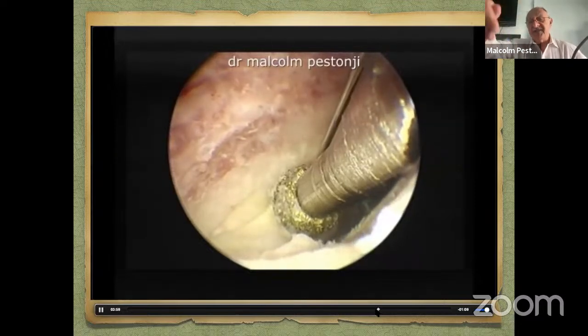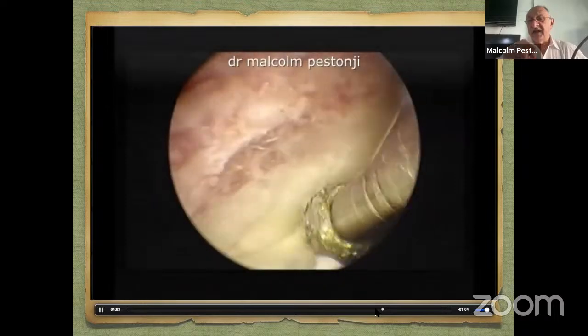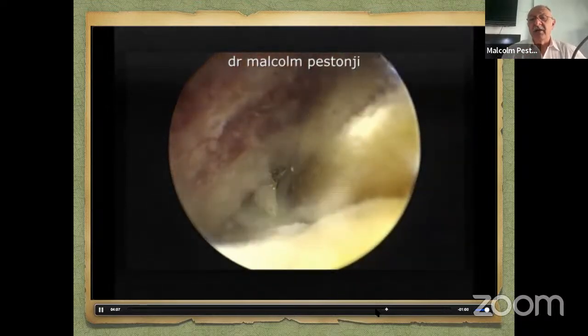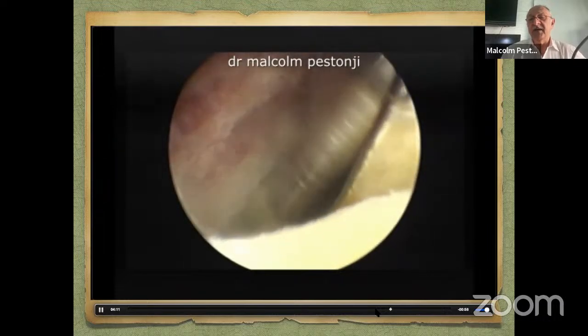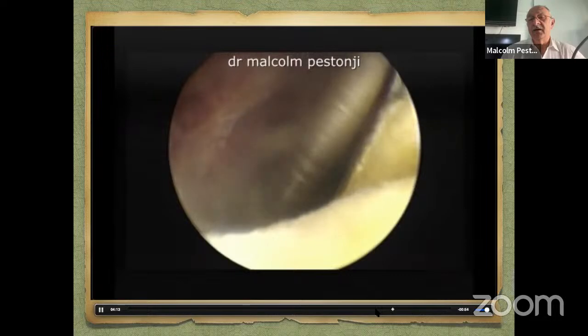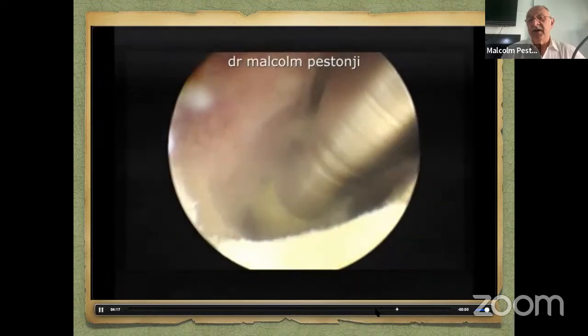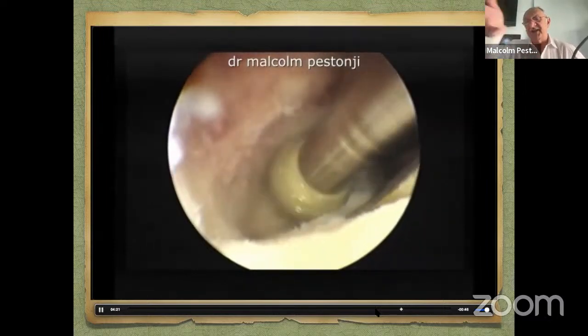Now I'm in the opposite lateral side, going undercut down, sublaminar. That is the facet joint over there, and that is the lateral recess side. This is the IAP, where the lower IAP is sweeping downwards, cortical bone. The lamina is turning into the IAP.